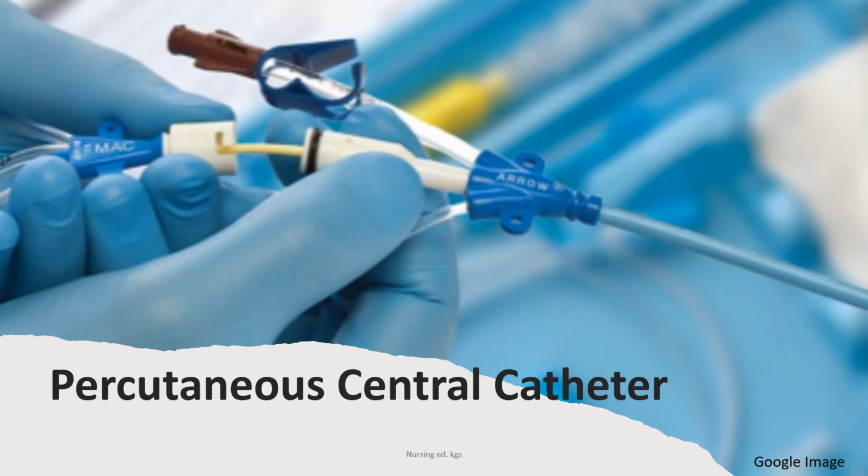Other examples of short-term catheters include multiple lumen short-term CVCs, percutaneous introducers, or temporary hemodialysis catheters.